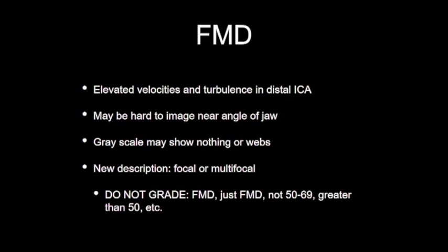And also remember that FMD frequently involves multiple circulations. So when you find FMD or suspect FMD, you want to confirm it. And we typically do that with a kind of total body CTA. We go basically from the head all the way down to the femorals. Okay?